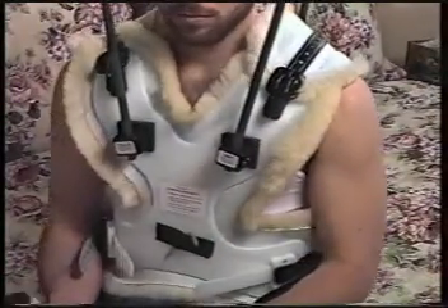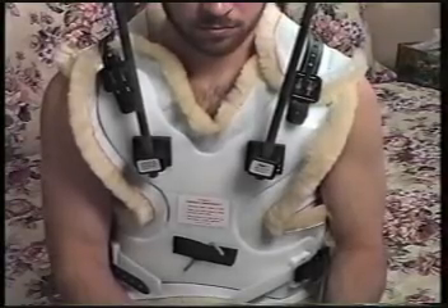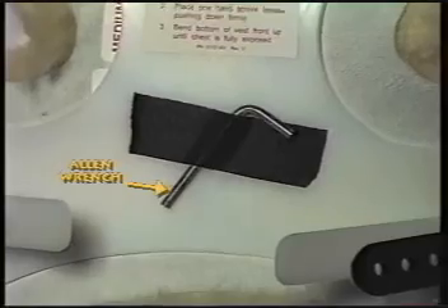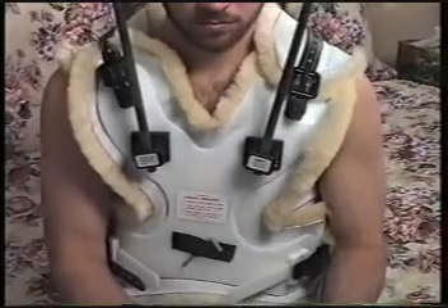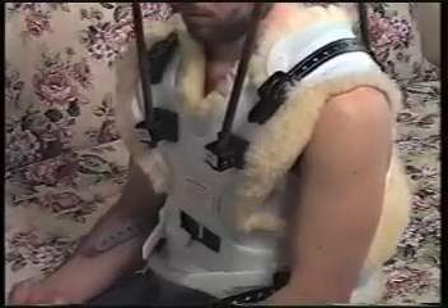If the vest becomes too tight, too loose, or if you have trouble sitting or moving, you might need a new one. Keep the Allen wrench fastened to the vest at all times in case of emergency. Do not make any changes to the vest on your own. If you notice any loose screws on the vest, call your doctor for instructions.